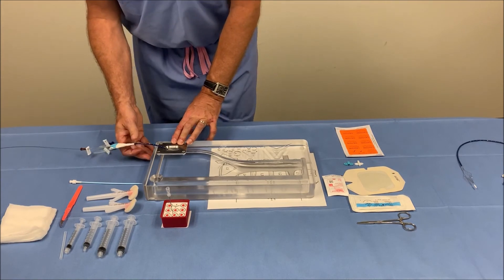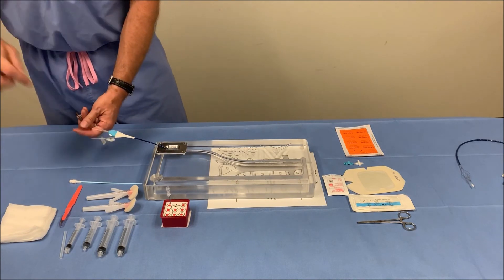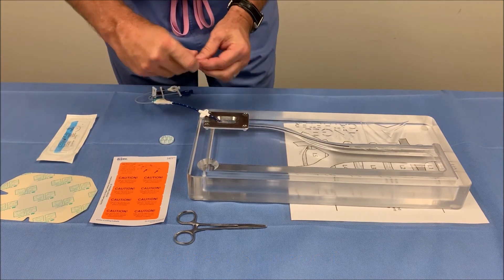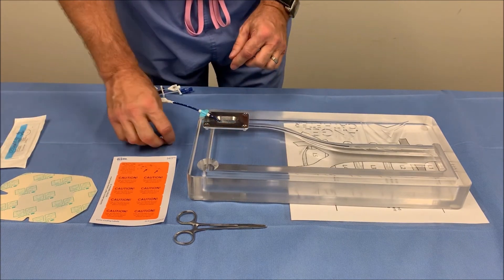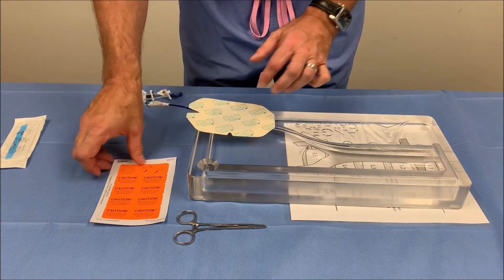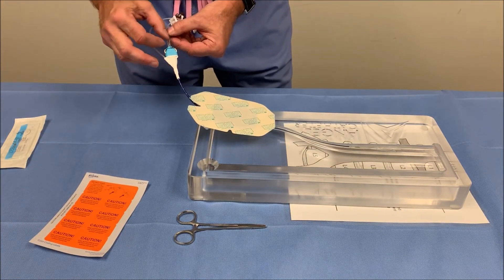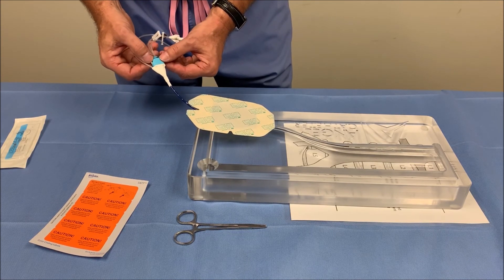Once you have it in its desired location, you can take a confirmed KUB, remove your wire and flush your brown lumen. To secure the catheter, take the suture wing and place it approximately one centimeter above the access site. Lock into place with the over clamp and suture to the skin. Now you can place your bio patch around the catheter and apply the tegaderm dressing. Place the orange sticker provided with the package to identify this as the Angel catheter. Lastly, take the excess suture material and tie it around the eyelets of the locking clamp to secure the filter into place.